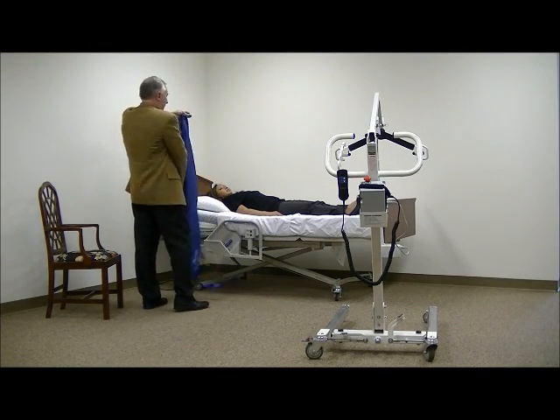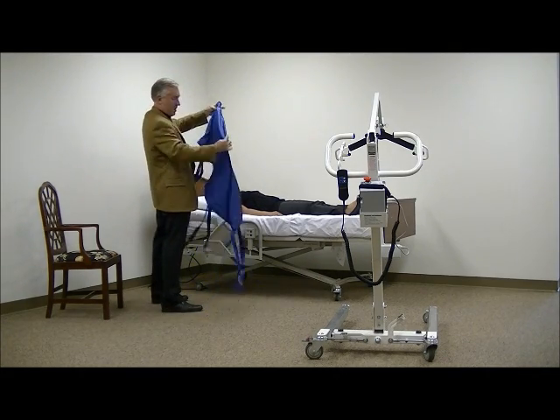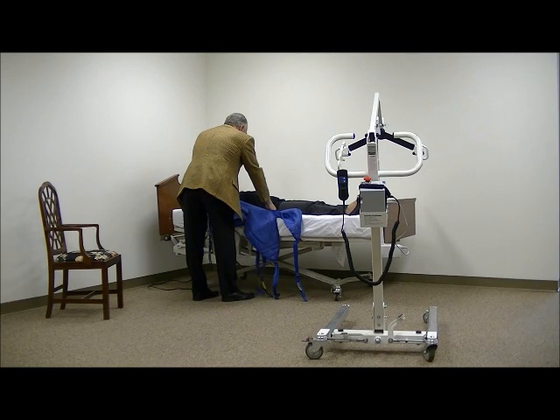So the way that you would do that is you would measure up your sling first to your patient to make sure you know where it's going to end up. Fold it in half, like so. Then you take a look here. Okay, we want it to be at the shoulders and right above the coccyx area, so right here.